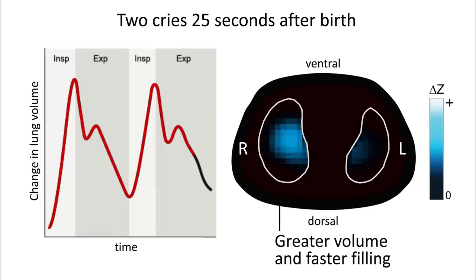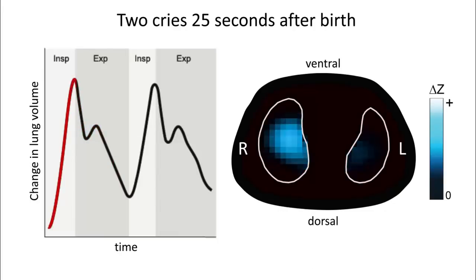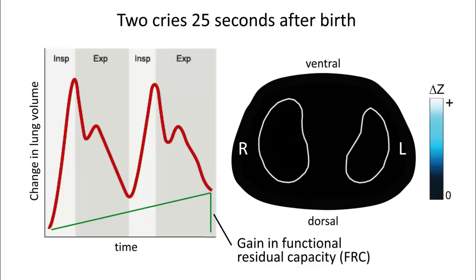More striking is the behaviour of the lung during expiration. Shortly after expiration begins, there is a cessation of expiratory gas flow and volume loss, followed by a brief redistribution of gas towards the ventral lung. The remainder of the expiration then occurs at a slower flow rate. At the end of expiration, lung volume is greater than at the start of the breath, indicating a gain in functional residual capacity.